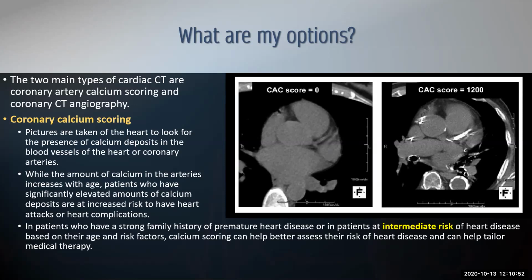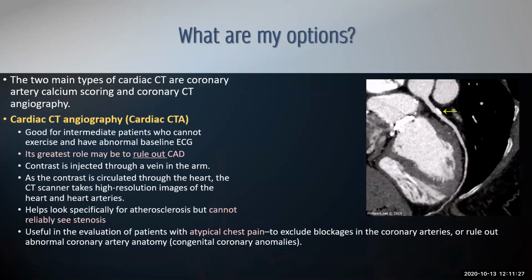Or maybe this would be a patient that you want to start aspirin on for primary prevention, even though there's been a lot of debate about that in the past year to a year and a half. This could be an imaging modality that you could use to help figure that out. Coronary calcium score is also used for intermediate ASCVD risk score, which is what I was just saying. So you can use aspirin and statin when you're having that discussion with patients. You can get this score and say, hey, I can show you the actual calcium you have built up in your heart, or I can give you the score, which we'll go over, to show you maybe that's going to push them into that range of, okay, now I'm okay with getting that statin added on.